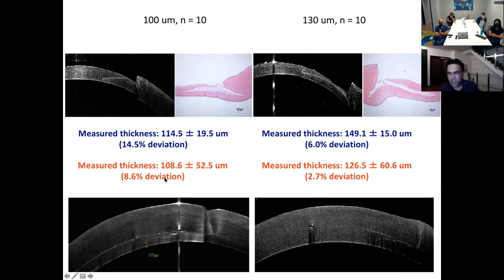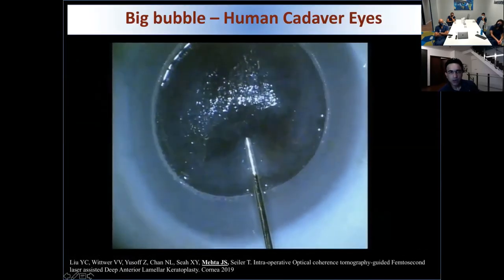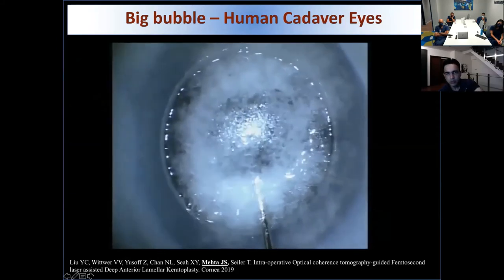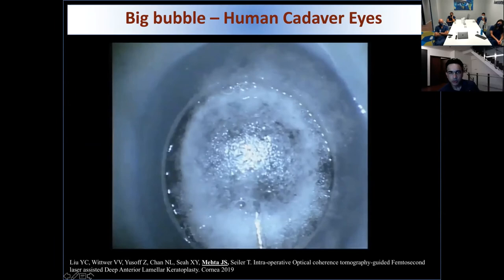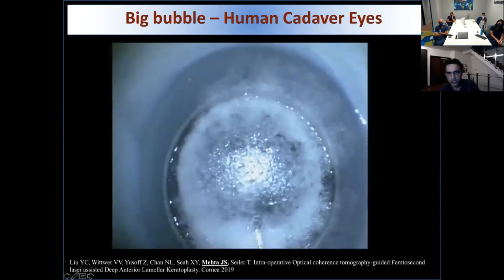We know we have to aim between about 100 or 80 microns away before you're going to initiate a big bubble. So this is using a human cadaver eye where I've used the laser to do the cutting, and I've used the cannula to just go into that hole. I'm injecting an air bubble, and you'll see a big bubble just being formed there now. So we have a big bubble formed around this area. This is typically a type 1 bubble. So the laser has cut the tunnel, it's cut the depth of the tunnel, and all I've done is enter the cannula inside the eye.